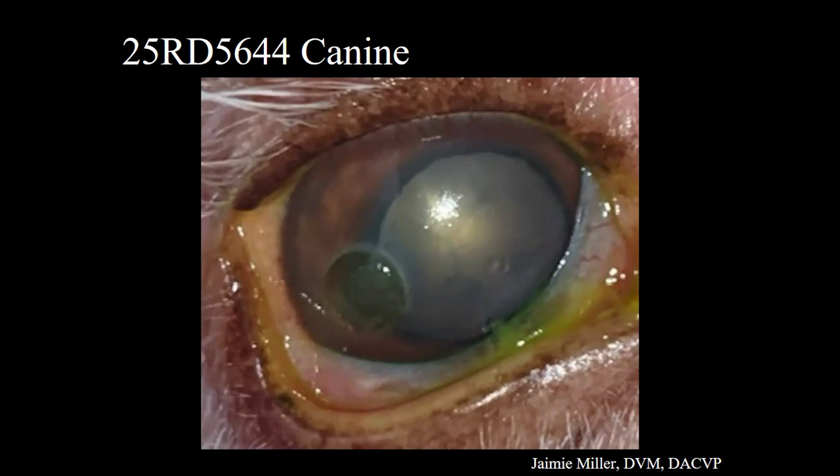The reason for the visit is this corneal perforation here, which they noted on their findings with iris and fibrin plug kind of prolapsing. So this is a nice little picture of that. There is also absolute keratoconjunctivitis sicca in this eye, and they diagnosed a late immature cataract with intumescence. They did say that the left eye was mydriatic with an incipient equatorial cataract and a normal fundus. There was no glaucoma in this eye.